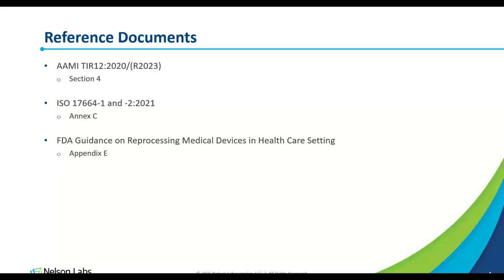But that is an excellent question, and that is the hardest part, is how can you determine cleanability? There's no clear answer. I would just look at these reference documents, and as you design the device, just keep an eye on, as you add a feature or as you are designing it, just keep these different lists in mind. And, as you accumulate more on your device, just know that that's going to impact your instructions down the line.